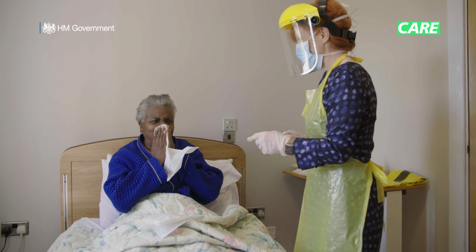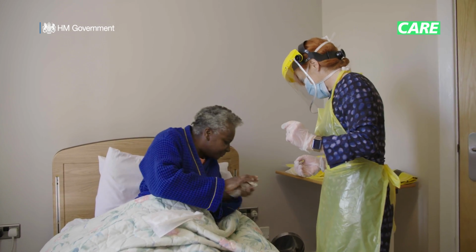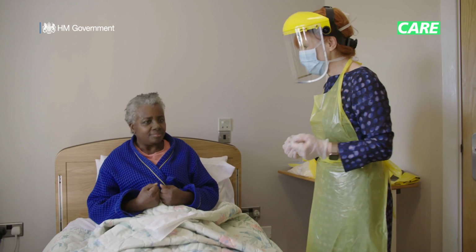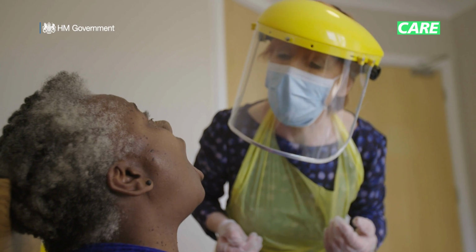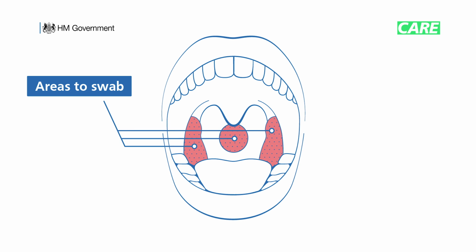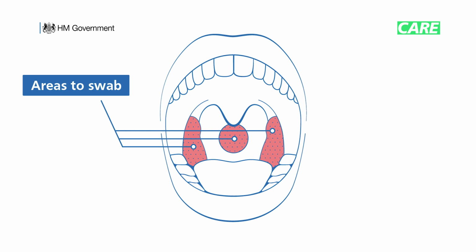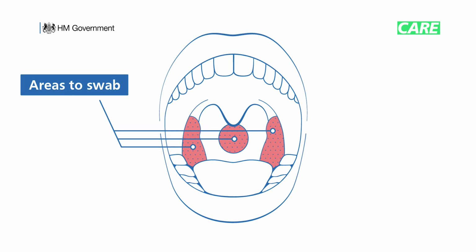Ask the person to gently blow their nose and cough into a tissue. Immediately dispose of the tissue in a bin. Look into the person's mouth to locate their tonsils. This is the area that you'll be swabbing. If the person's tonsils have been removed, swab in the area they would have been.